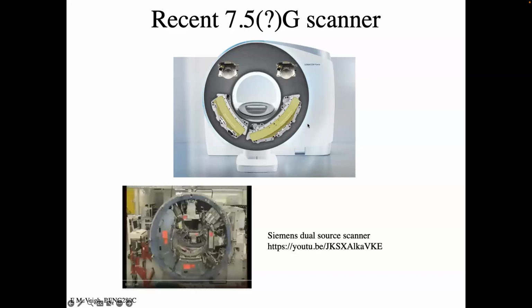They were going to go, they did go this way. The unfortunate part of it for cardiac scanning is that because there's only 64 slices and it's, say, an 8 centimeter throw or even less, 6 centimeters, something like that, you can't get the whole heart in one heartbeat, right? So if you want the entire heart at end systole, it's going to require 2 to 3 beats, and you're going to have to shift the detector or the patient through the detector and sample 3 different end systolic states and paste those together like they were one, right?